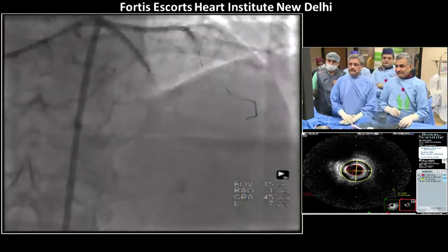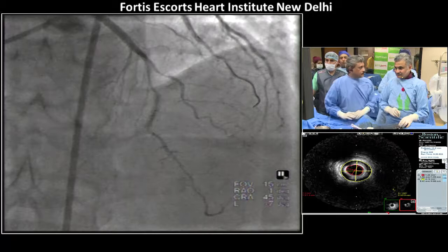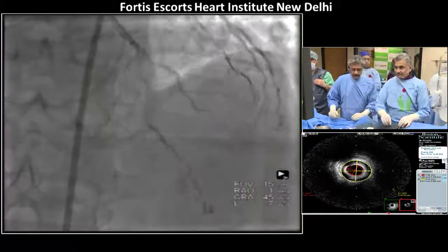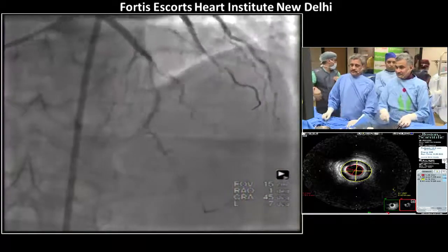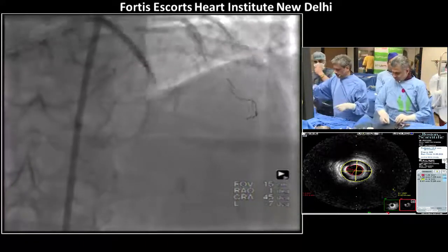This is Dr. Asadullah Hassani. I just want to ask a question: if again the LCX stent develops stent thrombosis, what should be the choice after that?